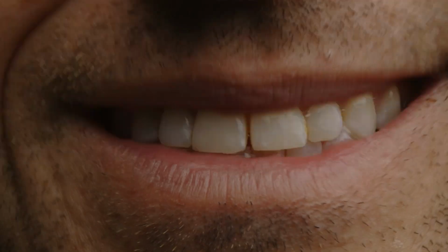And in fact, for these full arch cases now with implants replacing a full row of teeth, we don't even do try-ins anymore. We do prototypes. And the difference is that it's hard for you to try something in and say, okay, it looks great, I like it, it feels great. When we give you a prototype, you get to walk around, take it home, have your spouse look at it, have your family look at it, have your friends look at it, chew on it. We tell people, go home and have at it. Eat what you want, do what you want, smile, get feedback. It's the only real way to know if this is going to be what's right for you.